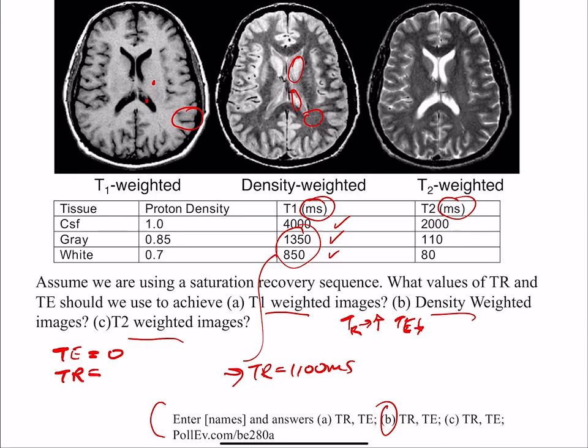Especially up here, you can really see the nice gray-white contrast, right? Basically all the wiring goes right up to the cortex, and then just that thin stuff around the brain is your cortex. Okay, question.